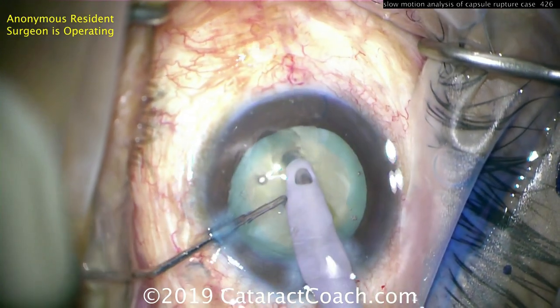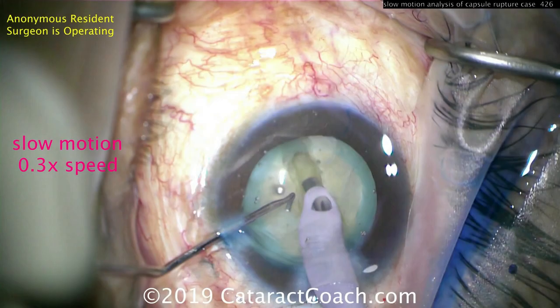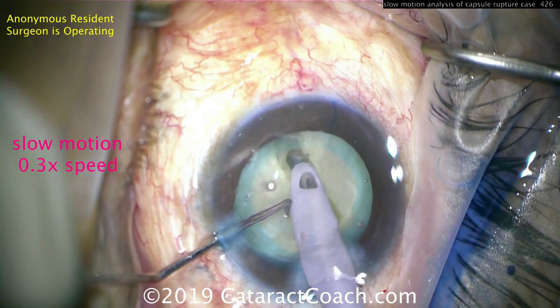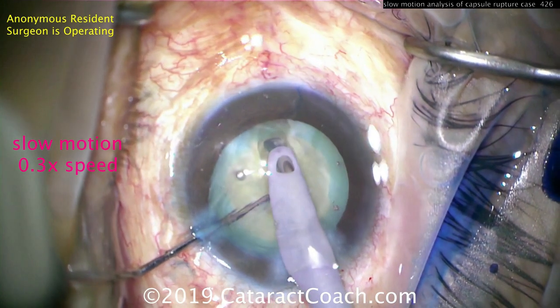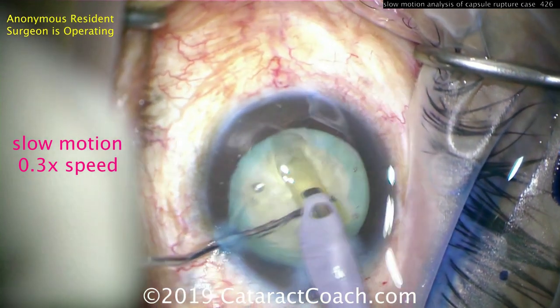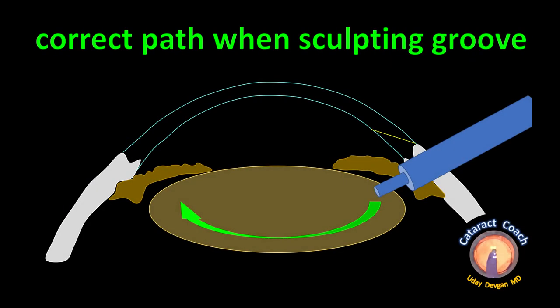I'll show you in real speed and then in slow motion. Boom — there's the groove; it looks okay, and then right there it goes too far, and there's the dark spot where the capsule is violated. Now showing at one-third speed: hitting the capsule right there — you can see how the tissue gives, and right afterwards there's a dark spot, that dark crescent — that is the violated capsule.